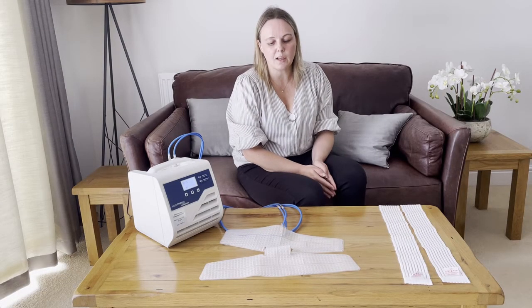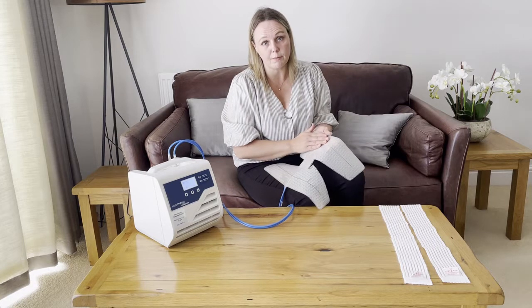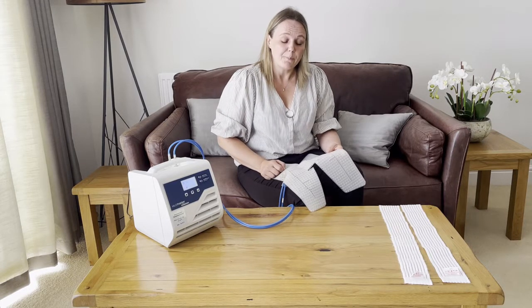Welcome to the cuff fitting guide for the Hilotherm knee cuff. Today I'm going to show you some hints on how to fit the knee cuff and some tips around using it. If you haven't already watched the user video for the HTP1 or for the clinic device, please do go and watch that. This video is designed for either patients using the knee cuff at home or medical professionals fitting the knee cuff to their patients.